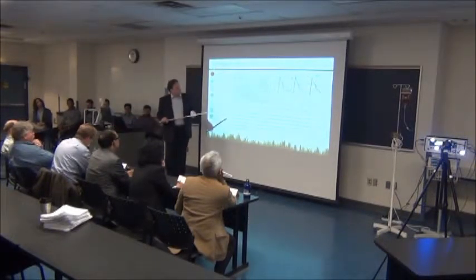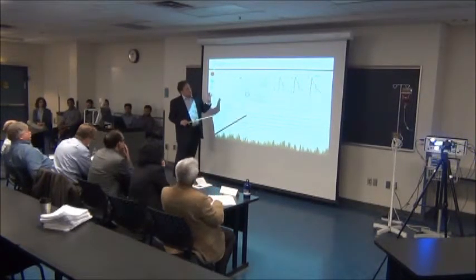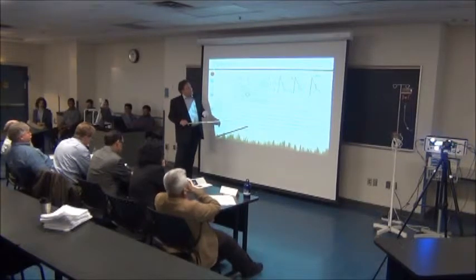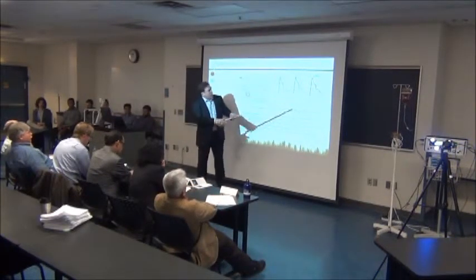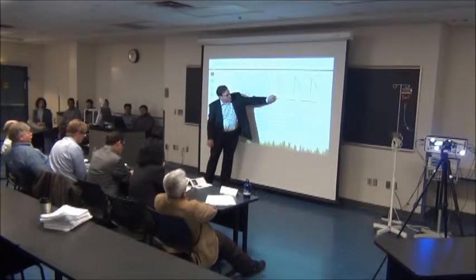So just because the transducer is like it is, if you open it to the atmosphere, that's sort of setting the stage. It's going to give you a flat line, say right here. And what we want is a knob we can adjust, and we can bring that flat line down here.